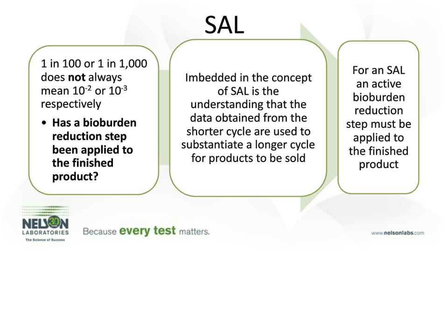That means that to truly have an SAL, there is some type of active bioburden reduction step which is being applied to the finished product.